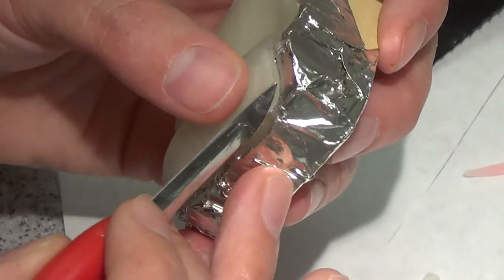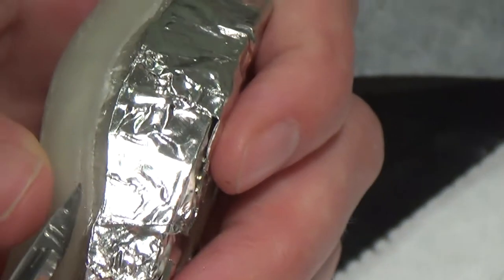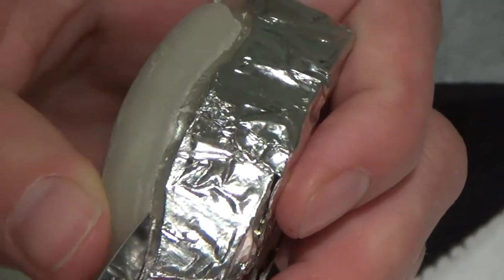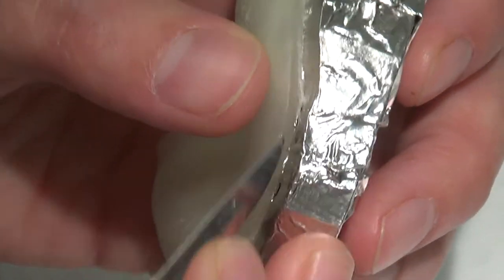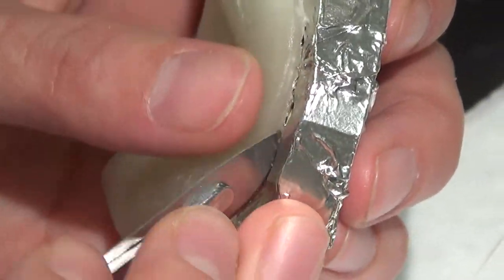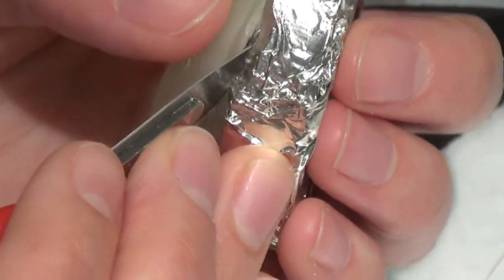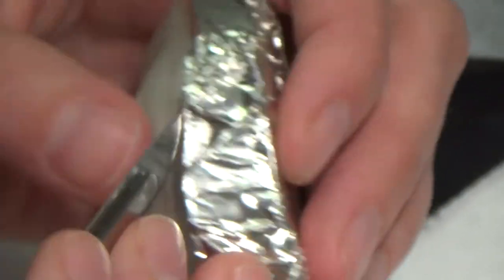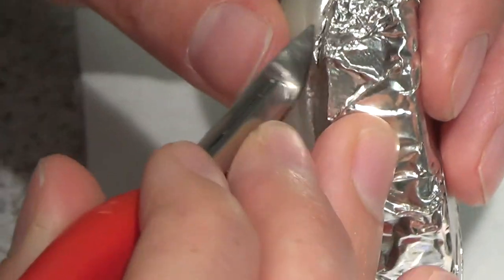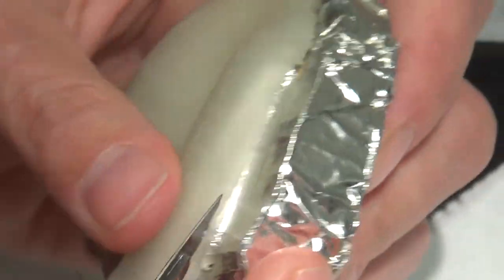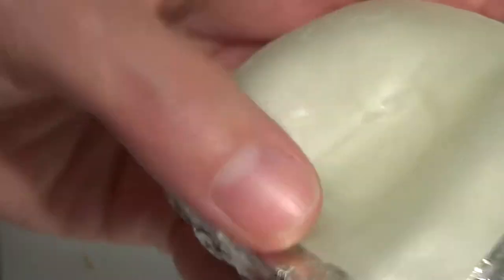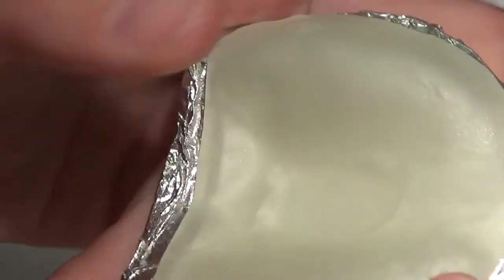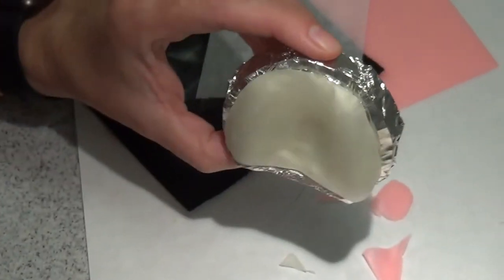I'm shaping this around the border that I made with that wax. So I'm being a little bit more technical with this one than I was with the one with teeth. Because now I really have to take this to a patient and use it on my patient. So you can see I'm spending a little more time adapting these borders, coming around and verifying that it is at the length that I want it. Because I don't really want to do a ton of trimming on this. I'm making this master impression on this patient tomorrow during my faculty practice time. And I don't want to spend 30 minutes adjusting it. So I'm going to get it really close. I'm happy with that.